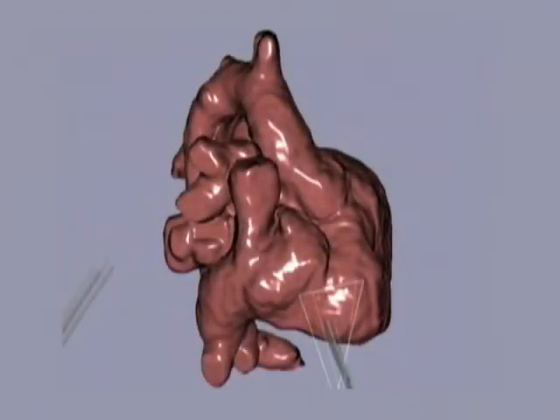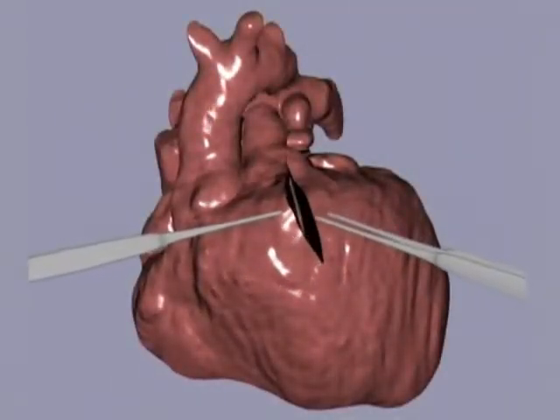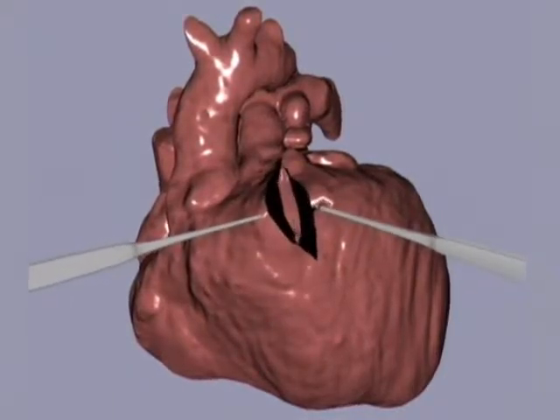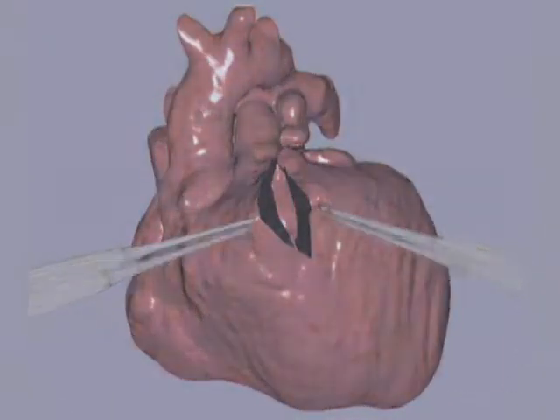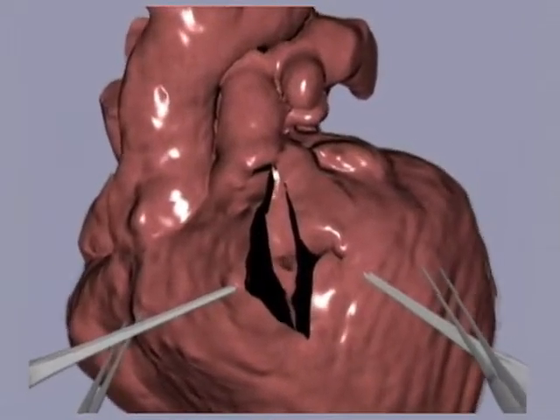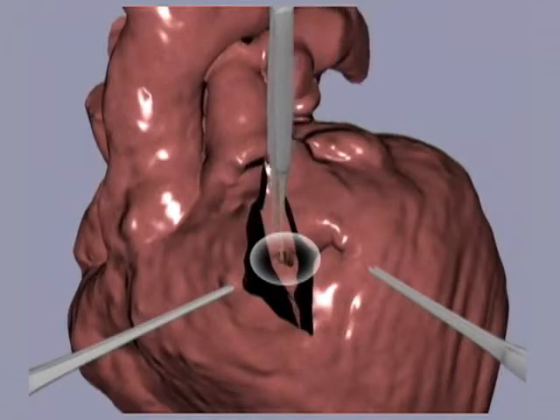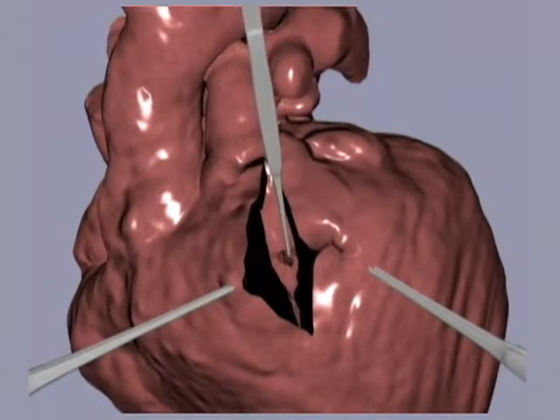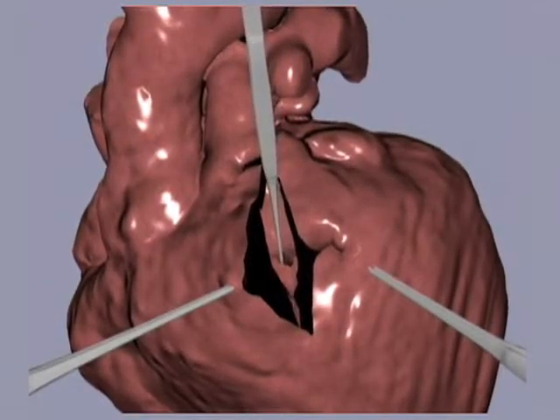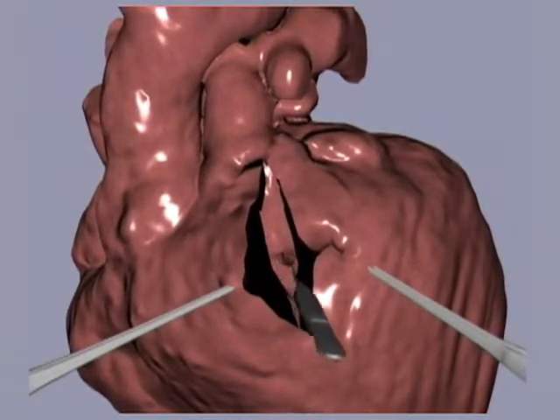It seems that the chosen incision point in the right atrium allows reasonable access to the defect. In order to localize the remaining defect, access through the right ventricle is achieved. When we zoom in on the incision point, the bigger of the two septal defects appears immediately. It is of vital importance to close this hole due to its size and position in order to avoid long-term damage to the heart and lungs.